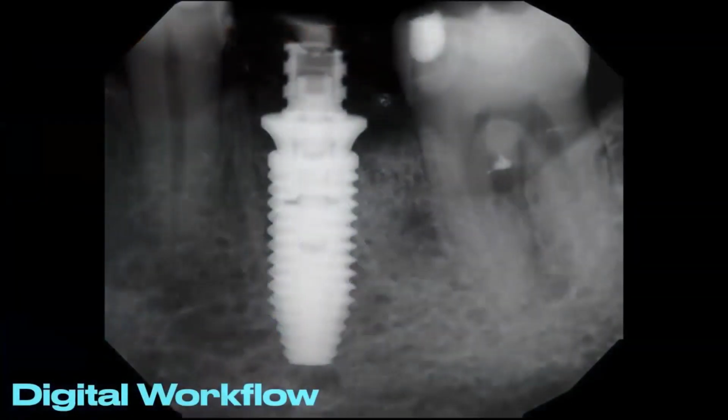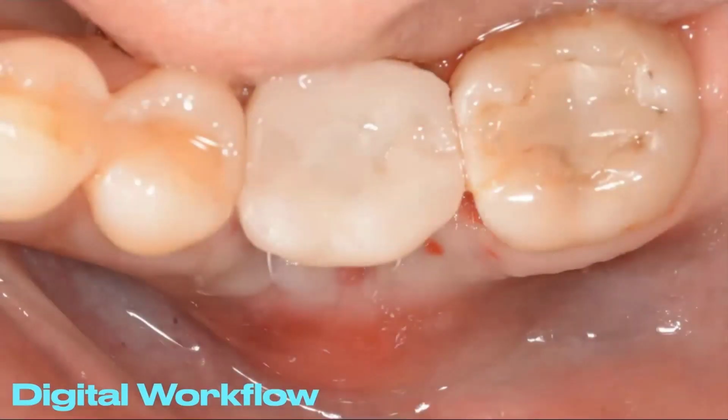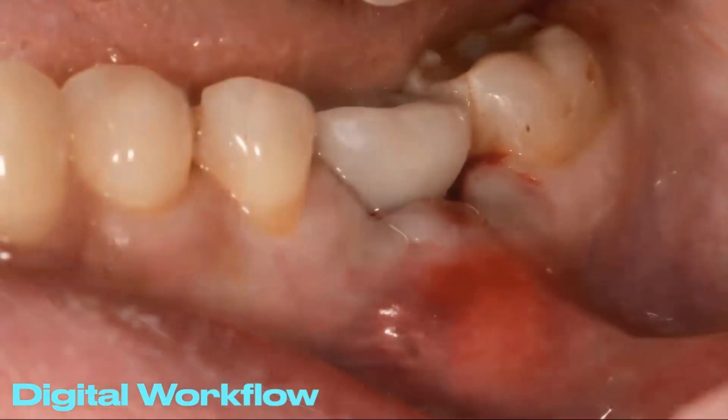In this particular case, we are able to place an implant right down the middle, right where it should be. We're able to put an on-one abutment on it right away and really spend the time to get things right, get a temporary on it, and it can look like that from the occlusal as a screw-retained temp on the day of surgery, and look like that from the buccal. You can see that we did a tunnel graft, we added a whole bunch of graft material and everything else to really get it right.